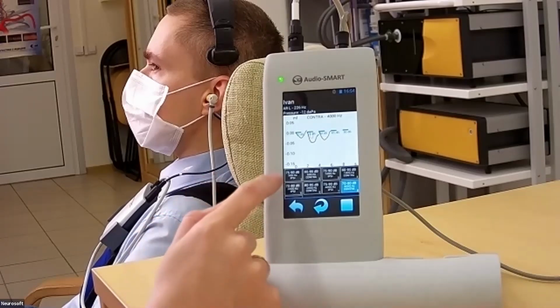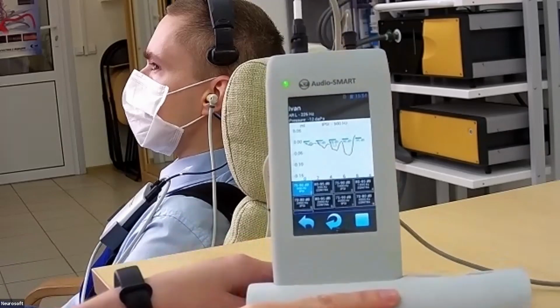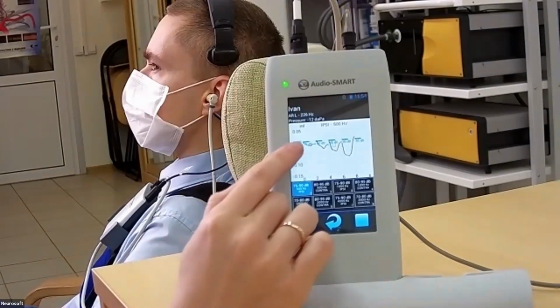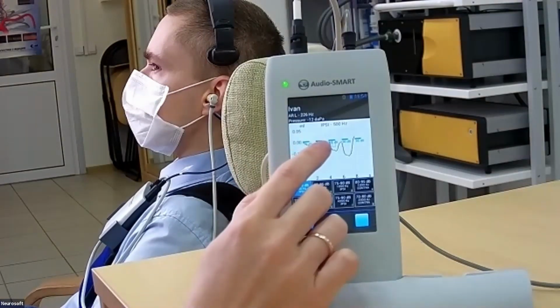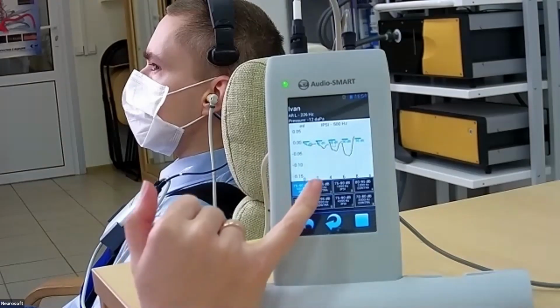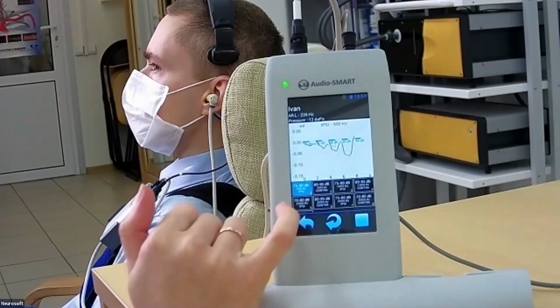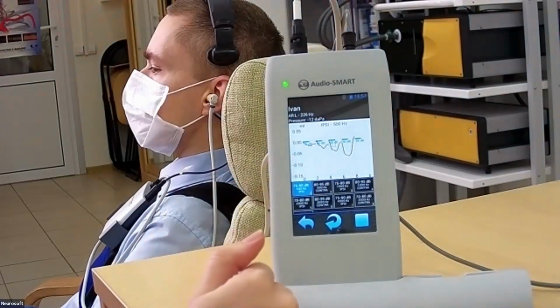And we can see in more details our curves of the reflex. They see that the device collected some curves before reflex, which is on the 85 dB in this case, and one after the reflex, additional.